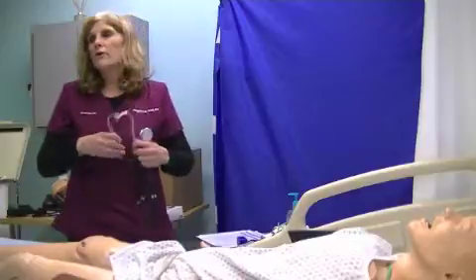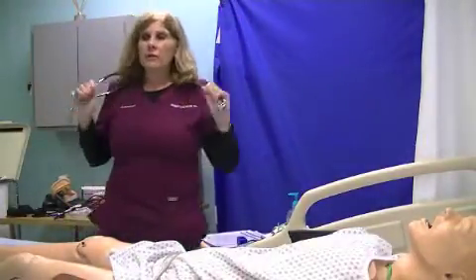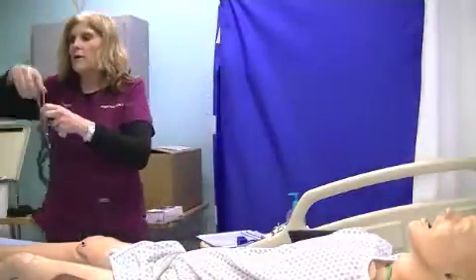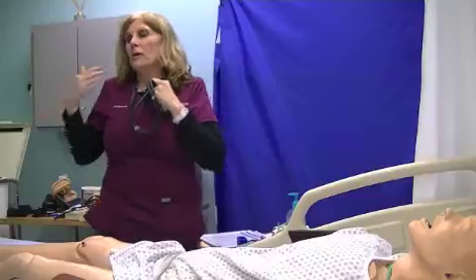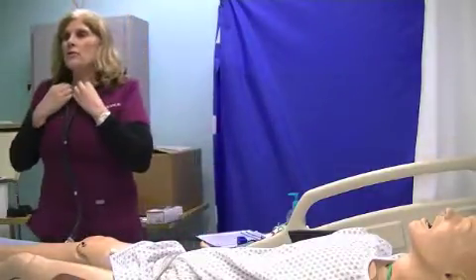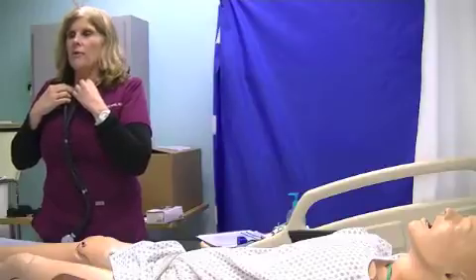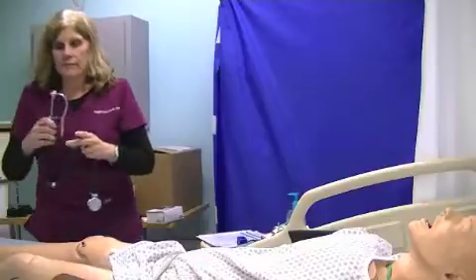By the way, if you're used to wearing a stethoscope like this, we no longer do that. We have patients that are confused, and they can take the stethoscope and strangle you with it. So we never want to wear it like that. Always wear the stethoscope around our neck like this, and we don't want to wear it room to room anymore. We want to take it off when we're not using it, because it spreads infection. If a person is wearing this all the time, going from one room to another, you can get infection. And if you have somebody that has dementia, and they go to pull this, guess what? It can come off, and it's not going to strangle you.